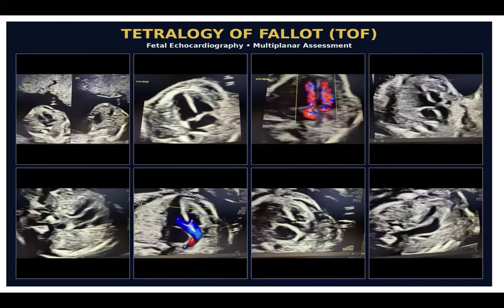But then when I go to my sweeping of my outflows, or naturally doing my sweep to demonstrate crisscrossing, this is where I start noticing things. I'm like, okay, what's happening? Why is there this angle here of this LVOT? It appeared that it was overriding dramatically over to that right side. And so that was my first clue. And then I'm still sweeping.